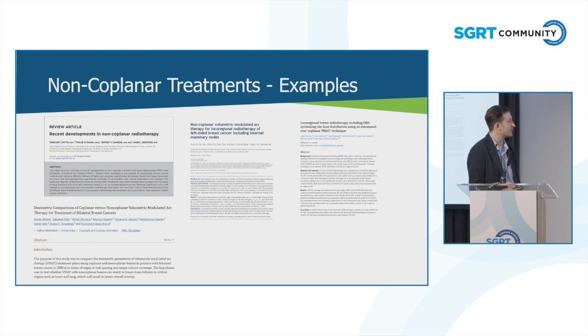So it's very helpful. In our evaluation, David was kind enough to send us a slew of surfaces that they scanned at their site for us to try to introduce non-coplanar approaches and see if that's going to benefit dosimetrically. In our sites, we don't do many non-coplanar outside SRS and SBRT, so it was interesting for us to see if in traditional plans for maybe breast or brain or lung or other body sites, it would be beneficial.